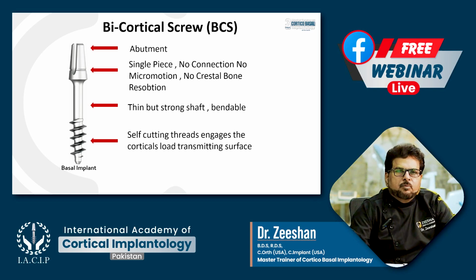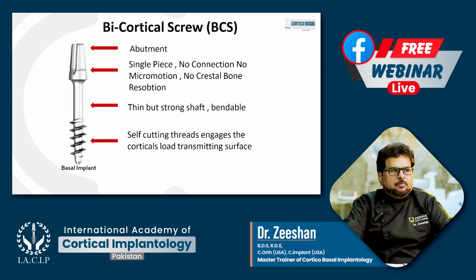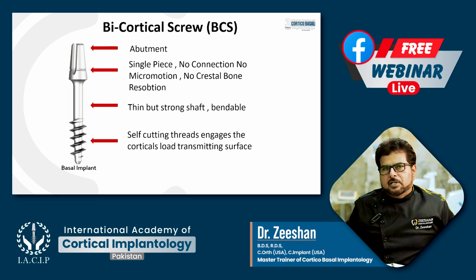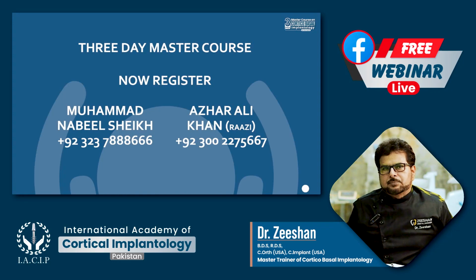One advantage of this basal implant is the self-cutting threads. They engage the cortical bone easily, and the other advantage is that they are thin and bendable. You can bend them and you don't have to do another surgery for placing the abutment. So see how you are achieving immediate loading with all those benefits for your patient.